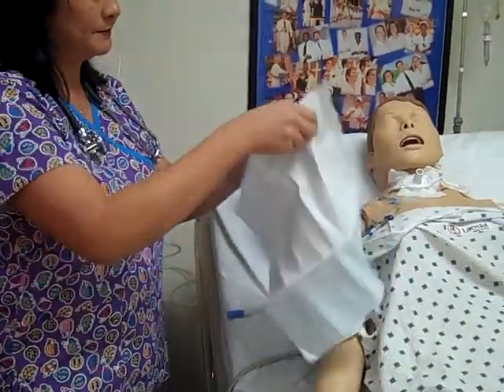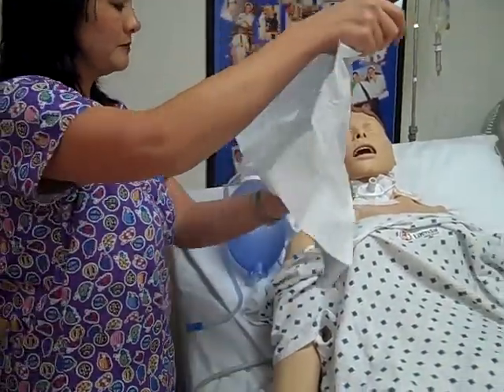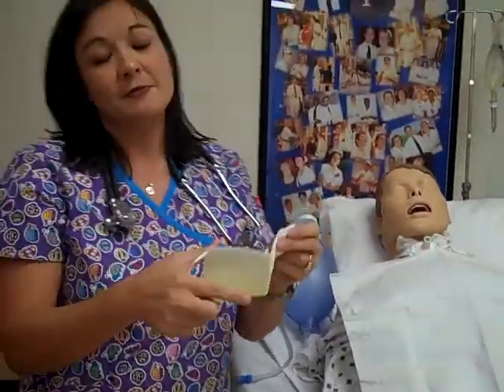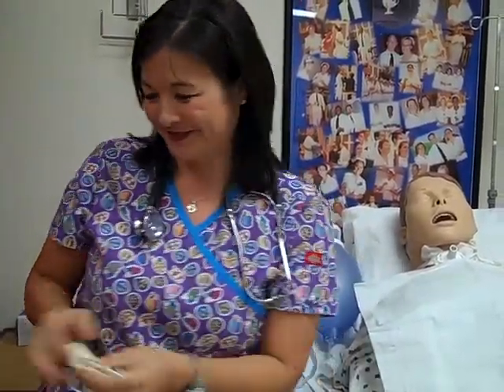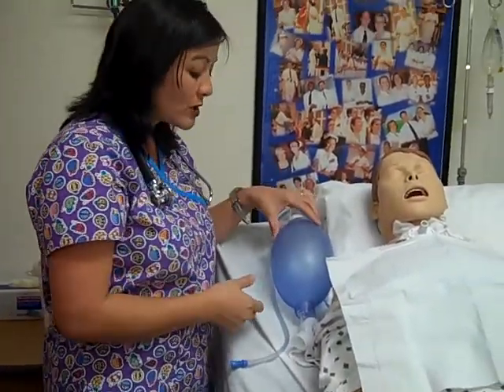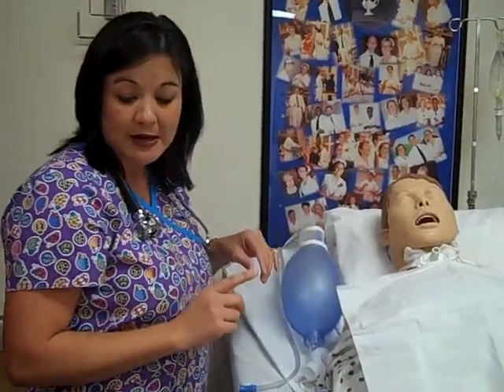Take my towel. For CPEs, you will just verbalize that you will use a mask — I will not actually make you put it on, because we want you to be able to breathe during your skill. So I'll put my mask on. Before I start, I want to be able to hyperoxygenate my patient.